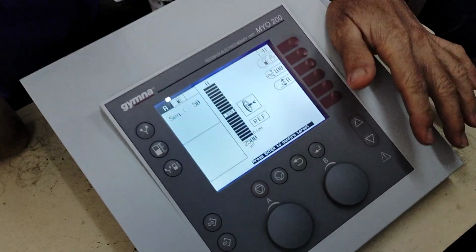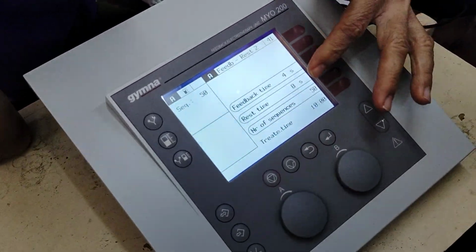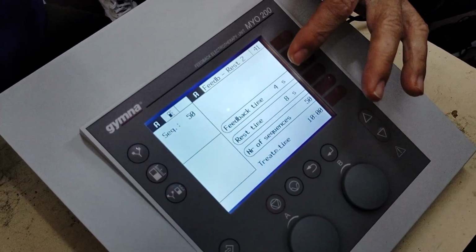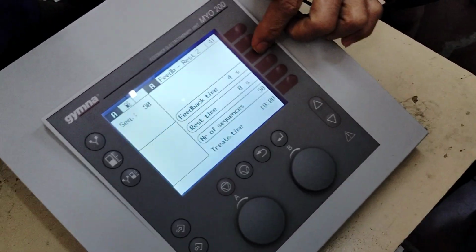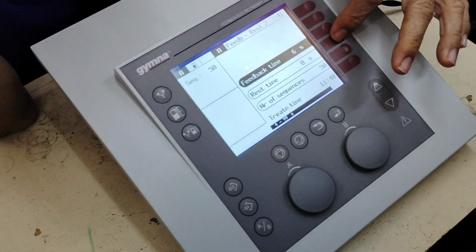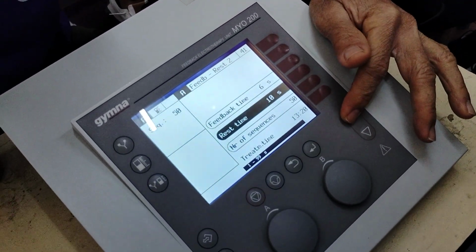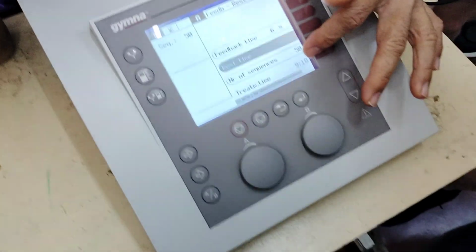The next step is to assess another card. Here, you adjust the contraction, the duration of the feedback. At the moment it's 4 seconds. If you want 6 seconds, then 6 seconds of feedback time, and then 5 seconds of rest. Your treatment time will automatically adjust.